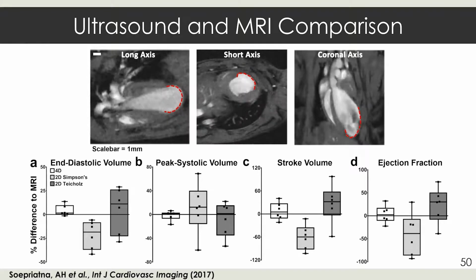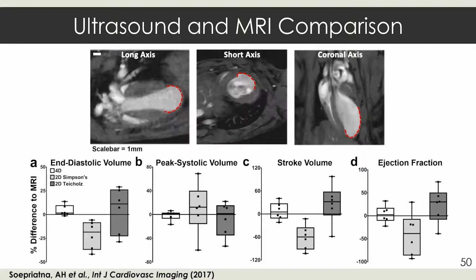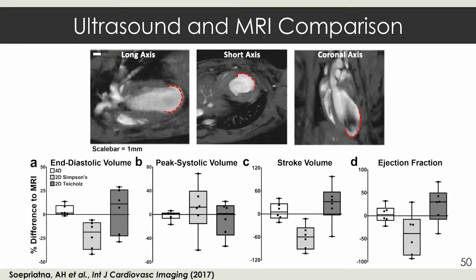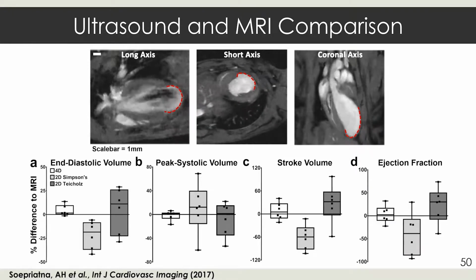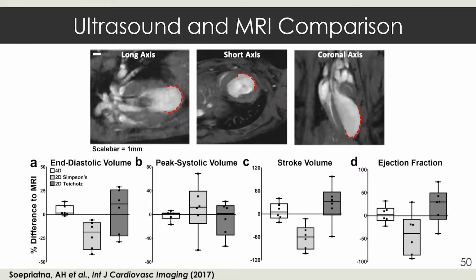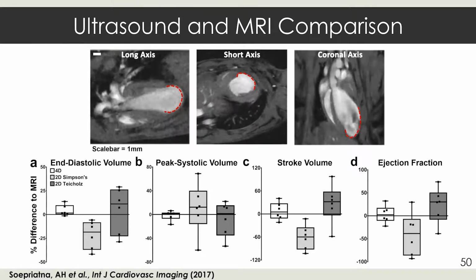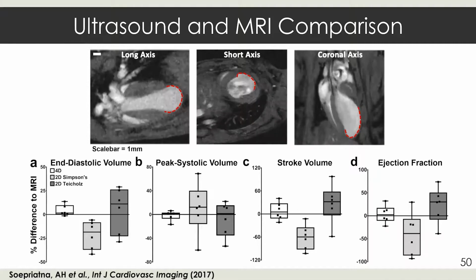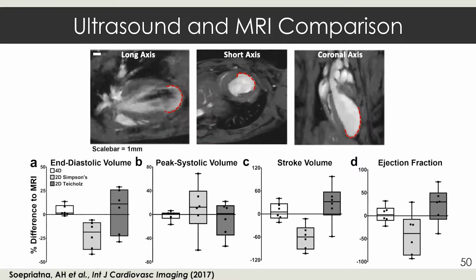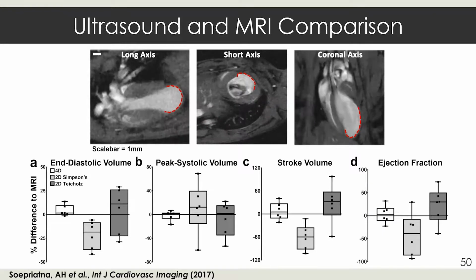And I'll add too that we put out a tomography paper in 2017 as well, where we did a comparison where I think it was a 40 micron step size, and we segmented every single slice from apex, below the apex, to above the base, and then we threw out every other slice and every third slice and every fourth slice, and got a sense of how many slices are actually needed to create a robust segmentation, and found that up until about 200 microns, you can get good segmentations with a 200 micron step size pretty reliably.